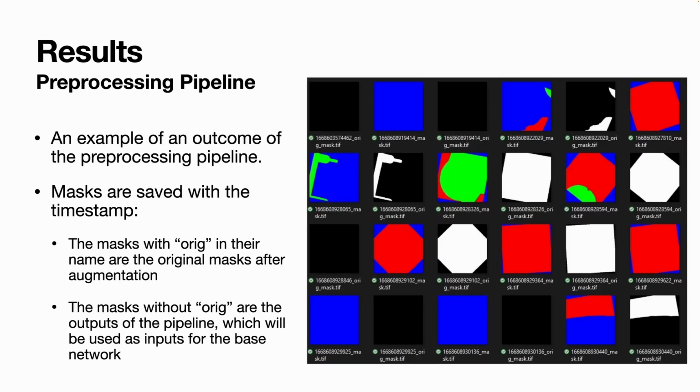Finally, after all the above steps are ensured to be correct, a simple pre-processing pipeline is built. This slide shows an example of input images, also known as data points, after the pre-processing is done. Saving images out is for debugging purposes only. And again, it is to ensure the input images are correct before the training phase.